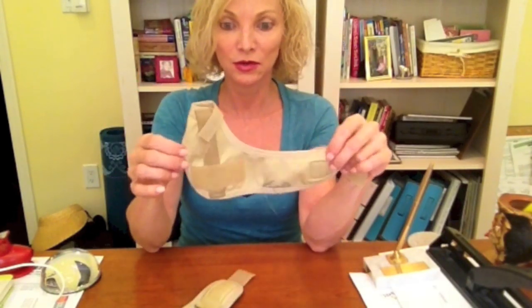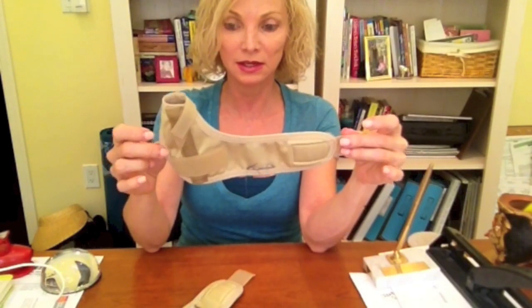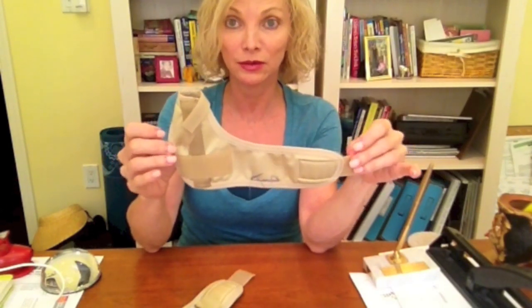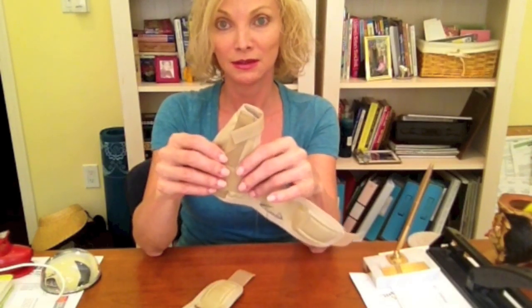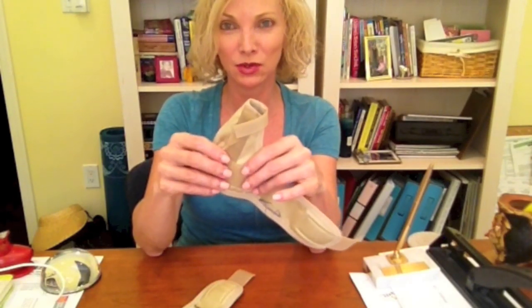The third and final pair are great because besides offering support — light support, not heavier or medium support — they're more of a light support, like when you're driving or around the house when you're not doing a lot of work.